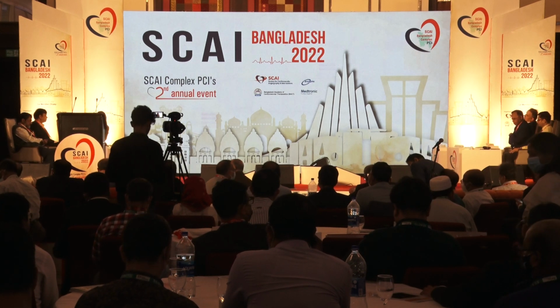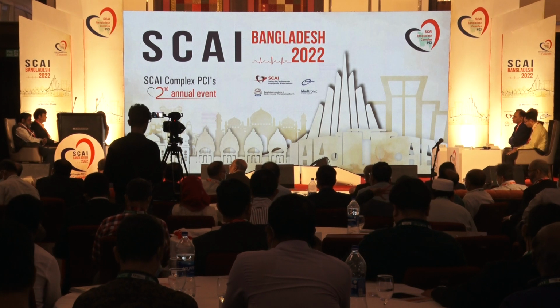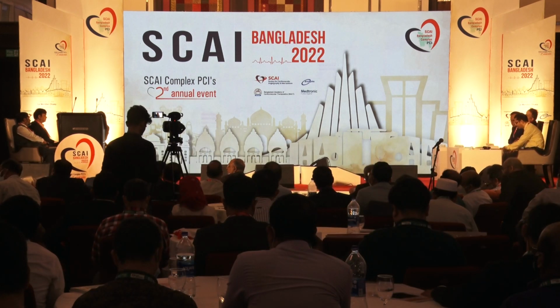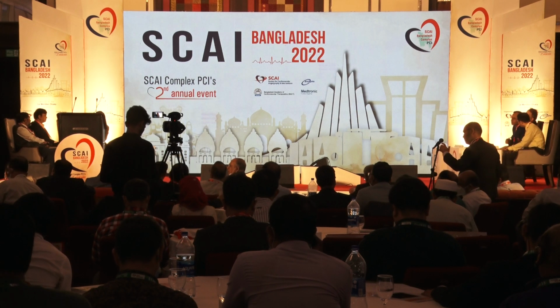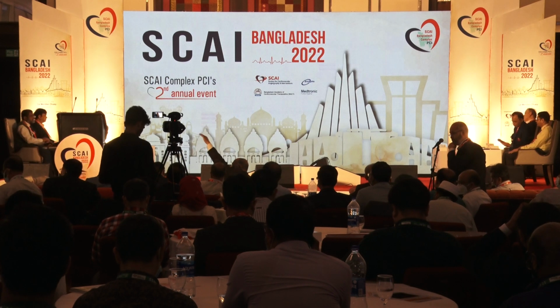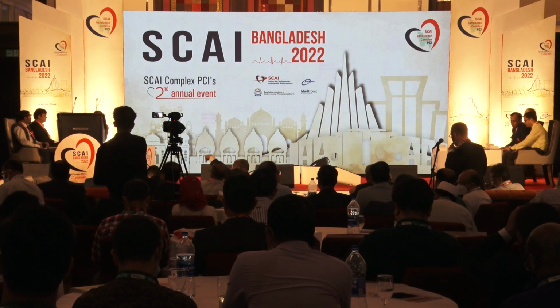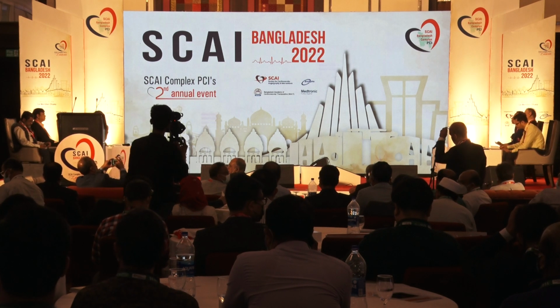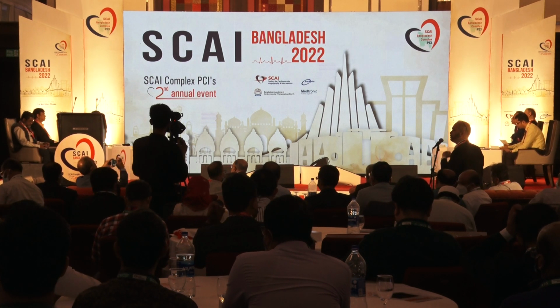Anyone who can say that they can differentiate between a 4.0 millimeter and a 4.5 millimeter by angiography and eye alone is very confident of themselves. I think that's very, very hard to do. The bigger the left main, the bigger the size, the harder it is to make small discrimination. So in those cases, imaging is incredibly important.